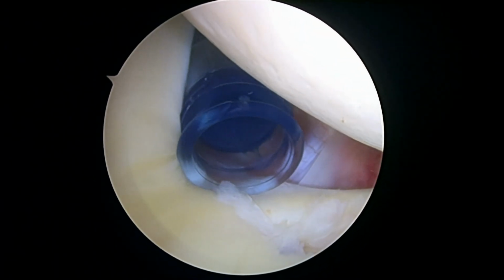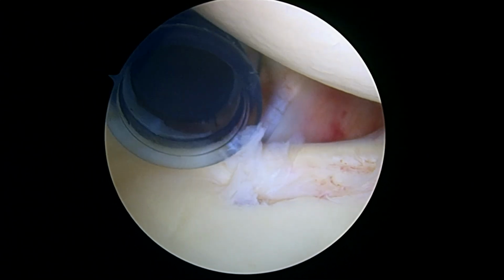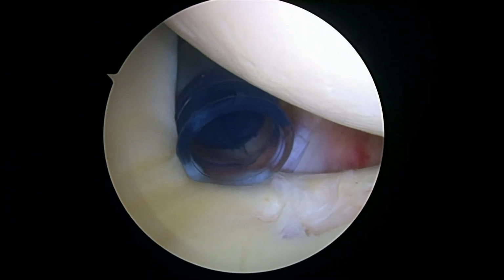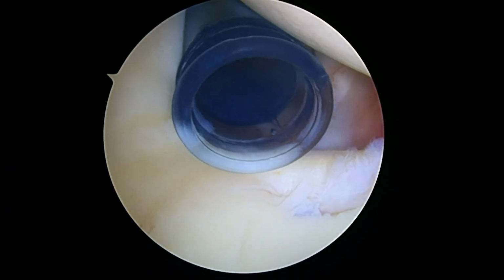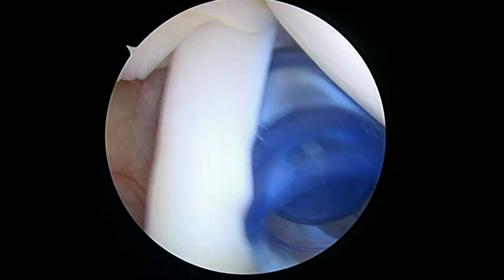All right, Dr. Buford, we're just getting started on the right shoulder. We're looking in from the back to the front. Everything's magnified a lot, as much as 40 times. And right now we can see a blue cannula coming in the front. Your biceps tendon is this structure running up between 6 and 12 o'clock on the screen.